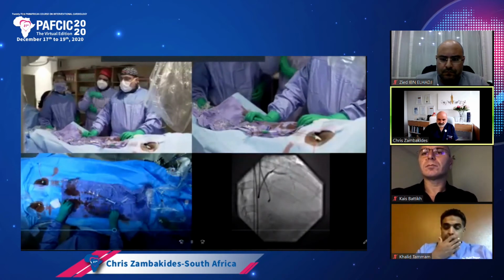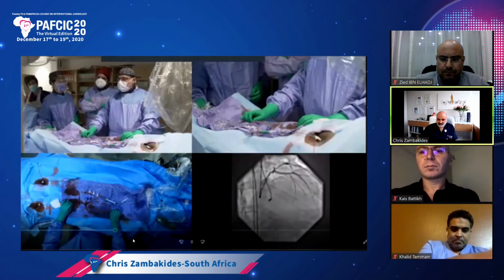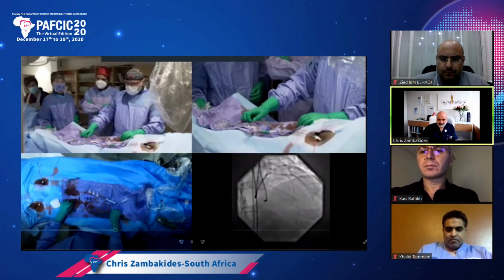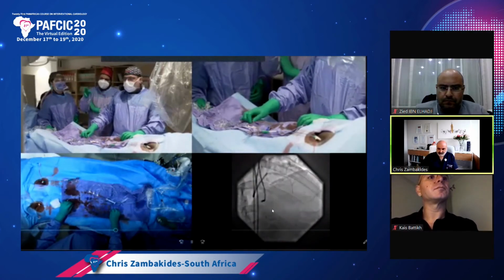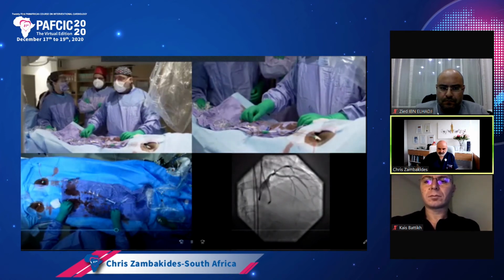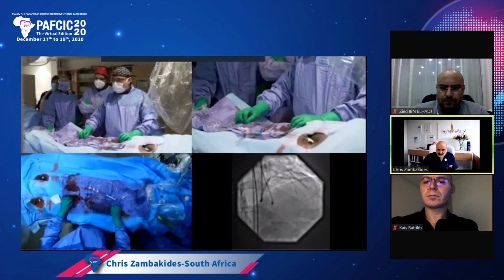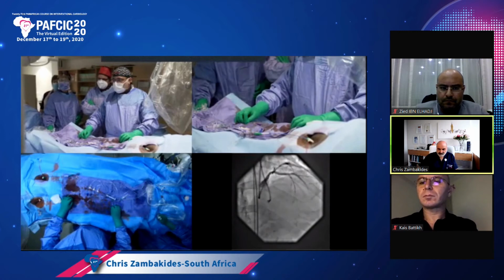Okay, so go through to the AP. Yeah, we're going to do that now. So let's get our microcatheter down. Let's go to the AP cranial. So you're at the bifurcation where you're sitting now. Yeah, so that's the bifurcation going up.